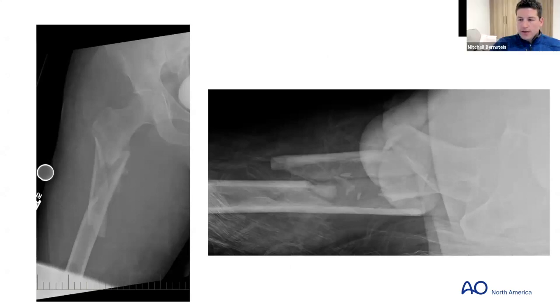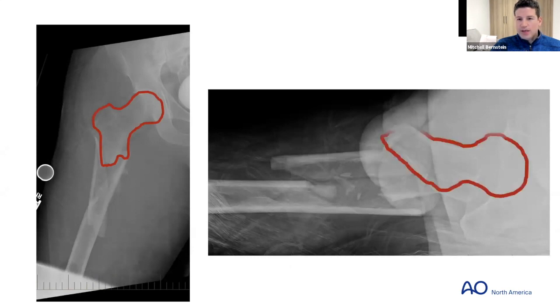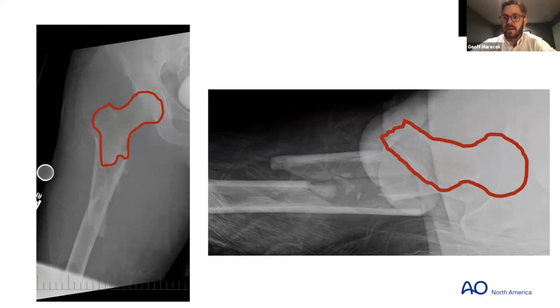So very good comments. So again, focusing on the head neck segment in the AP and sagittal plane. These are pretty good X-rays to show exactly those deforming forces. Would you agree, Jeff? No matter what amount of closed reduction or traction, especially sagittal alignment may not be reduced without physical manipulation? Yes, no amount of axial traction will reduce that flexion.